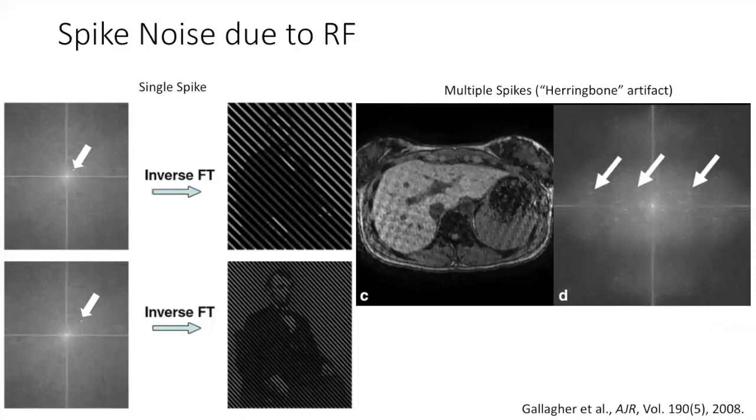And so I think that's the easiest way to think about how k-space is being filled for a particular object. Break it down by what spatial frequencies you'd expect, with the center of k-space being the smaller spatial frequencies, corresponding to the coarse portion of the object, and then the high spatial frequencies as you go out, kind of in the diagonals.